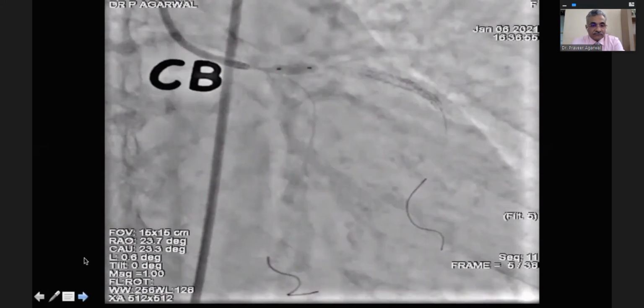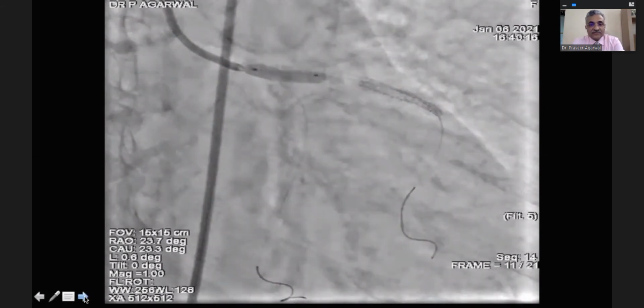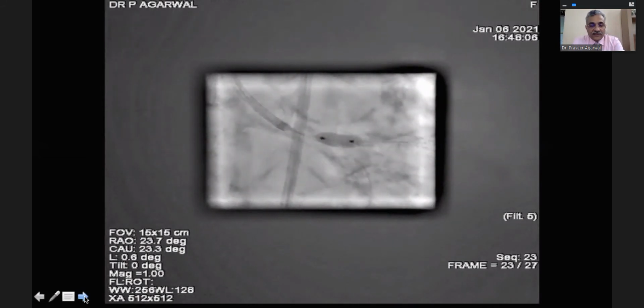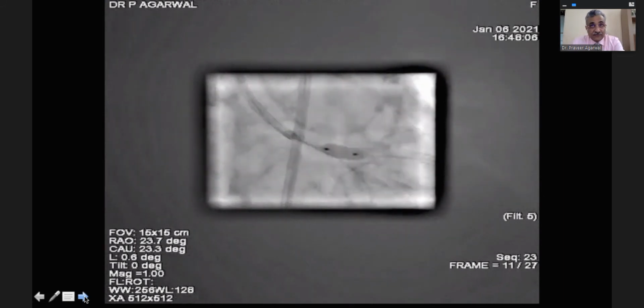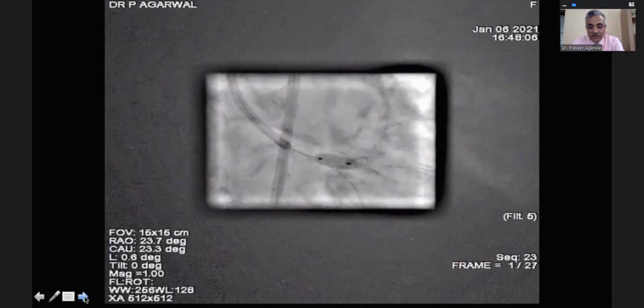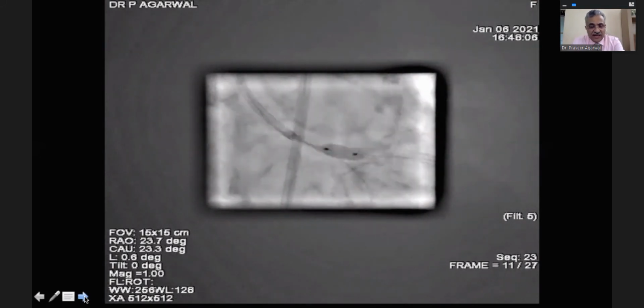Let's go to the next one. Deployed at nominal pressure, reasonable opening. Then this is a post dilatation because proximally the vessel was looking 5.5, 5.6. So this was about a 5 mm balloon, a short balloon. Did it at reasonably high pressure, about 18 atmospheres.